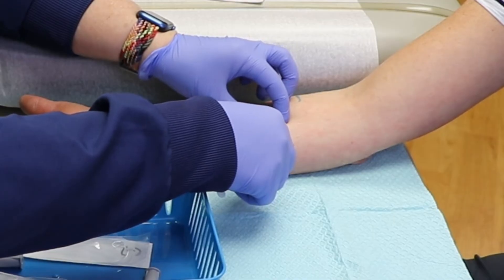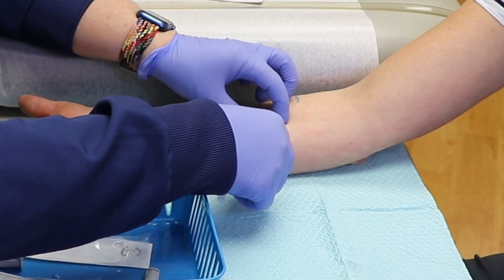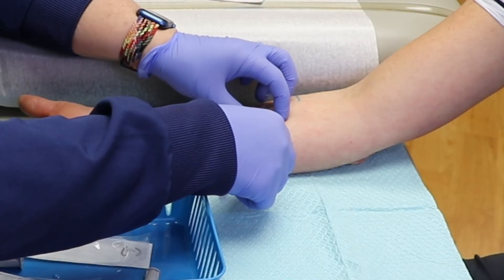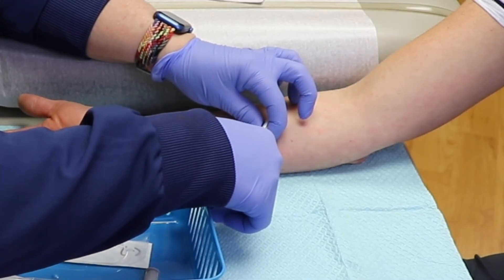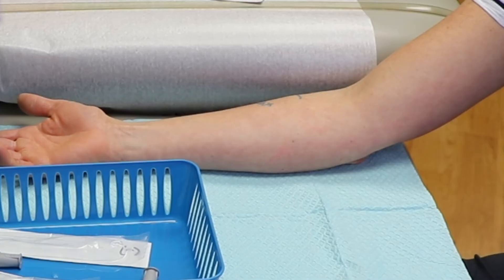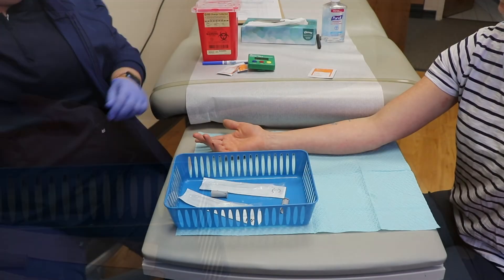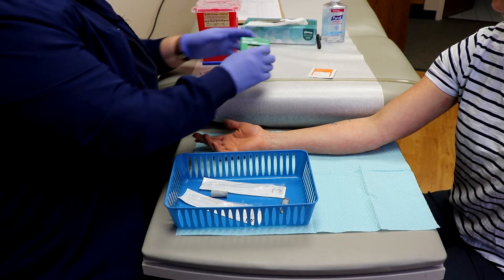Some patients have compared it to the feeling of being stung by a bee. If an allergy is indicated, it will look and feel like a mosquito bite with redness all around it. A positive and negative control will be used to compare the results on the skin. The reactions will occur within 15 minutes.